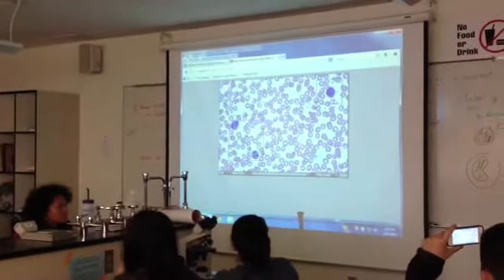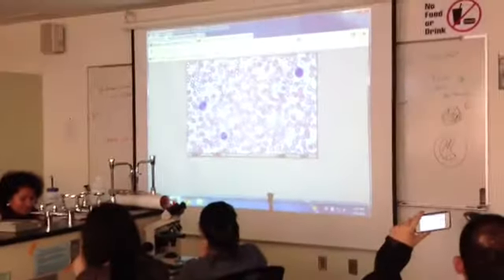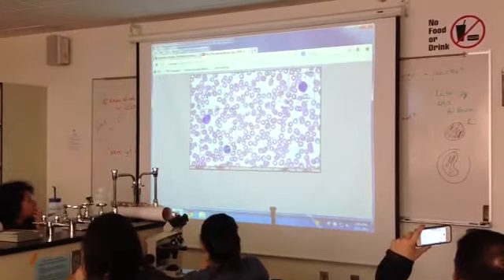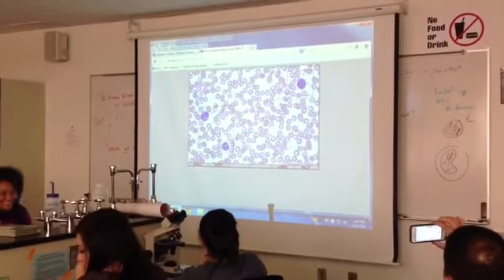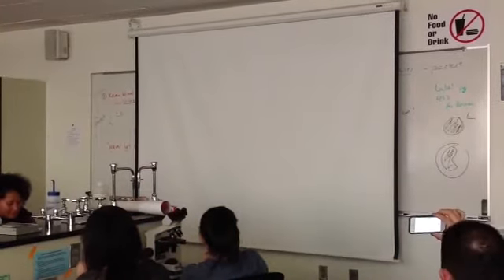Right. And also because PCC is thou shalt know. That's also why you're learning this. The more you know the blood cells, the easier it is to diagnose someone just from the blood count. You can say eosinophils are up, you got some parasite. You went to South America for your honeymoon. Make sense? So thou shalt know in blood cells. Look for nucleus, look for coloring, speckles, look for shape. Practice, practice, practice. Take a picture of that poster with your phone.